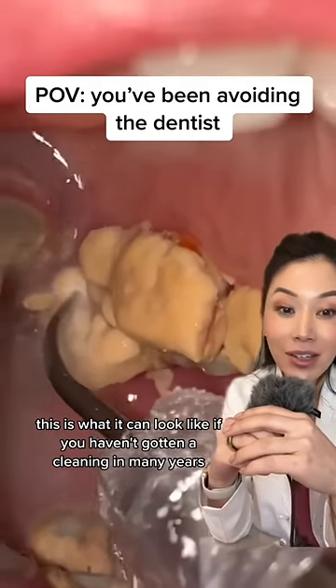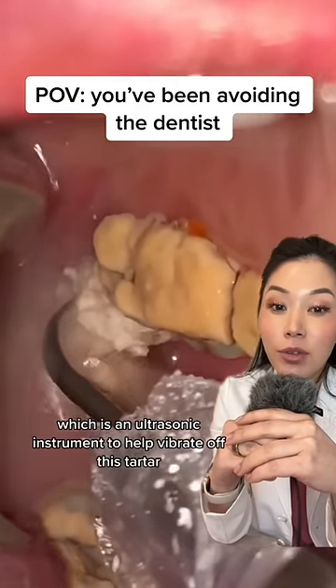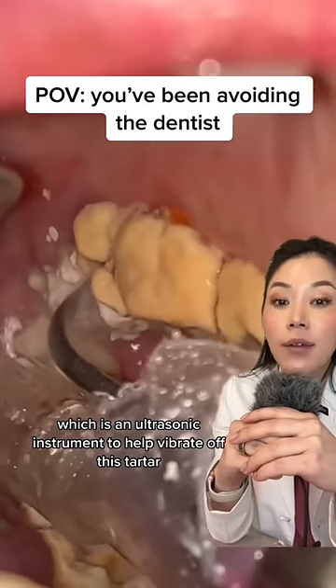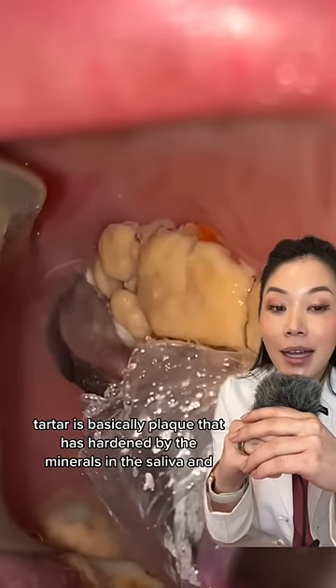This is what it can look like if you haven't gotten a cleaning in many years. Here they're using a cavitron, which is an ultrasonic instrument to help vibrate off this tartar. Tartar is basically plaque that has hardened by the minerals in the saliva.